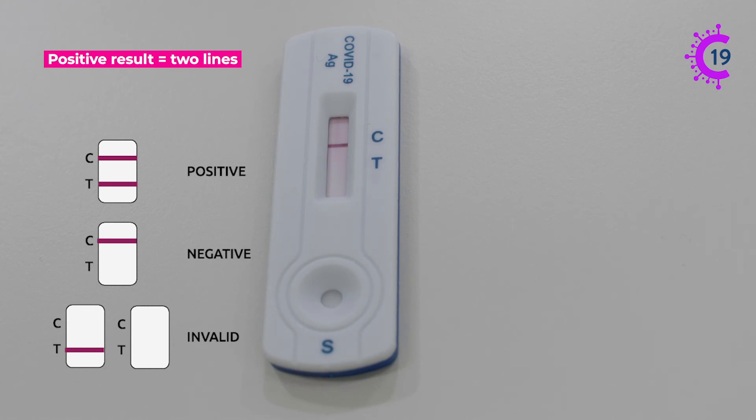After 15 minutes your cassette should show a result. There should always be a line visible by the C for control. If this is not present it's best to repeat the test using a fresh kit.